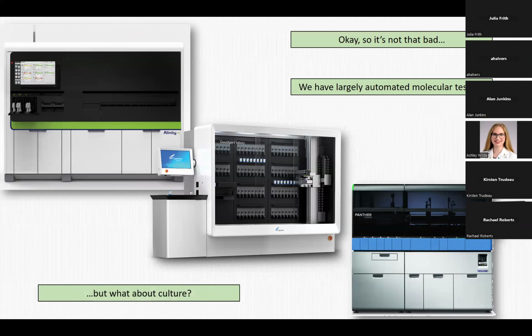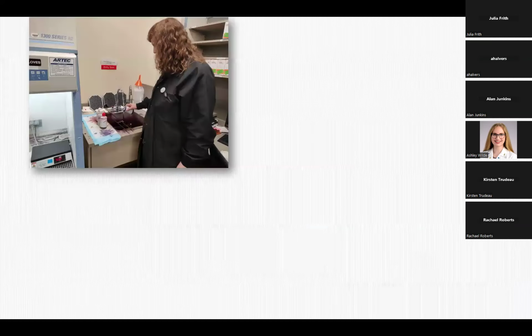But what about culture? You see, culture really hasn't changed much. This is Karen, and she's standing there. She's doing a gram stain basically the same way that we have always done gram stains. Pouring your little bottle of crystal violet on there, and that's it.